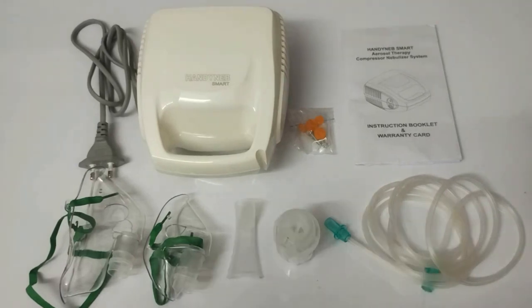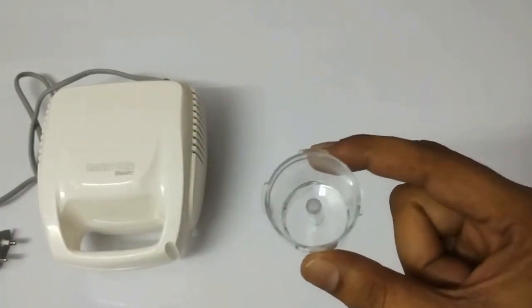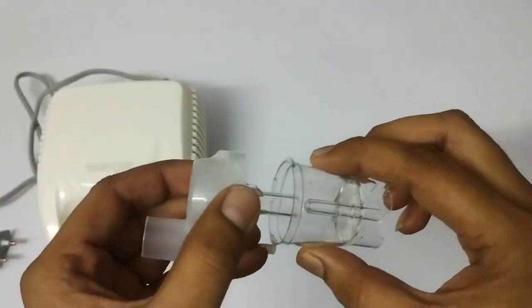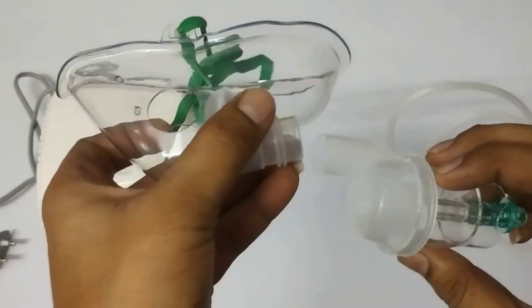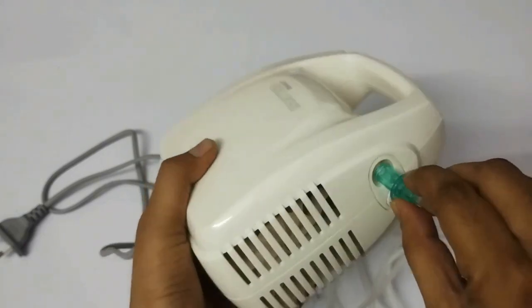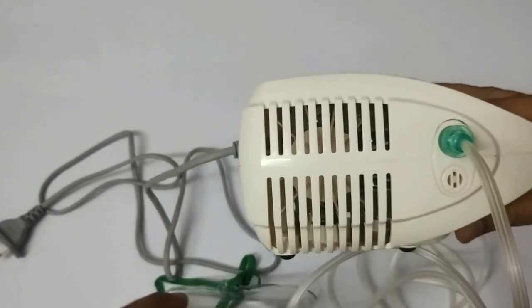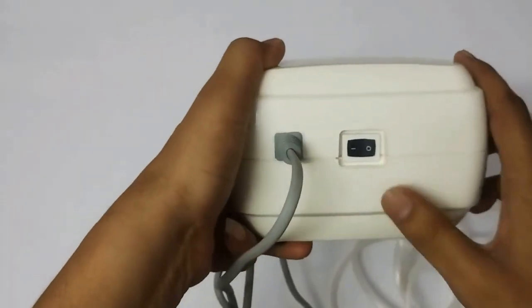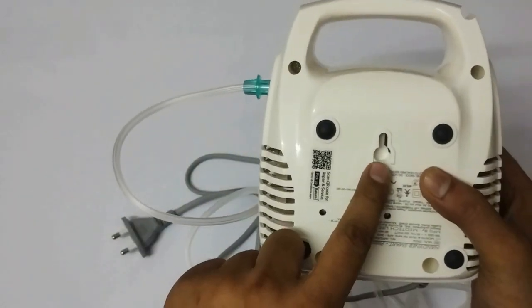Now we are going to set up the nebulizer. I'm going to use it with the adult mask. First, fill the medicine cup with your medicine, then close it. Attach the hose and connect it to your mask. The hose connects to the Handyneb unit here. Below this we have the filter — to change it you can do so on the left side. There is a ventilation slot, and on the back side we have the on/off button, plus a carrying handle. If you want to mount it on the wall, you can do so with screws included in the package.